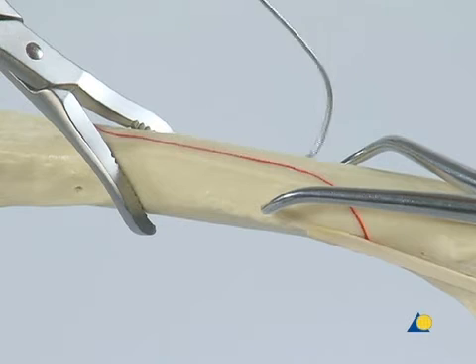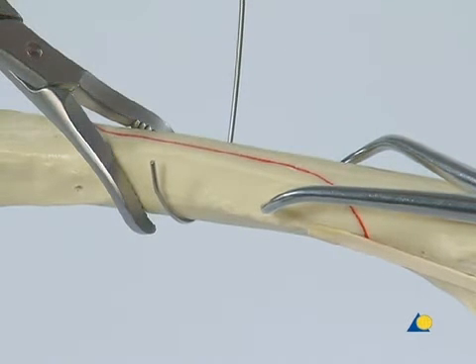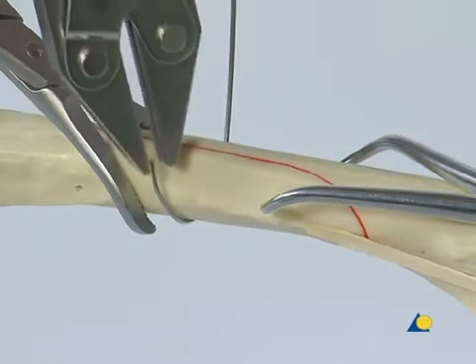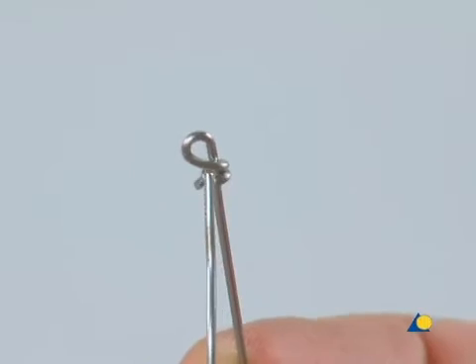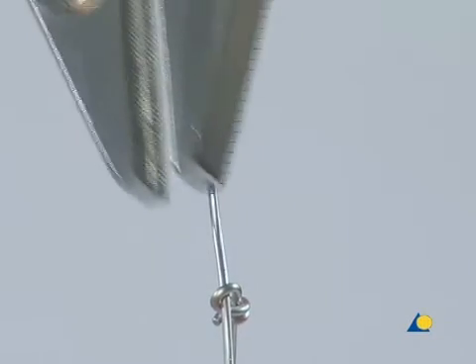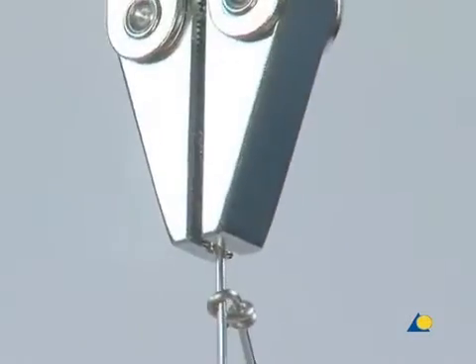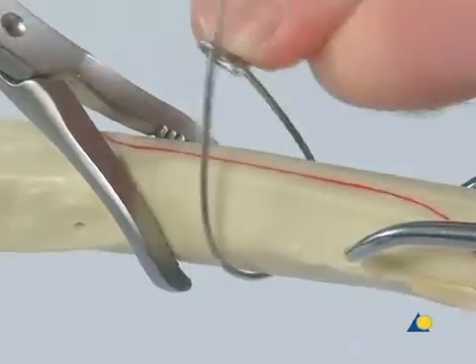A curve is made in the straight end of a cerclage wire with eye, and this end is passed around the bone with the help of the parallel pliers. The straight end of the wire is inserted through the eye at the other end of the wire. The wire is pulled using the parallel pliers, and the eye is slid down to the bone using the thumb.